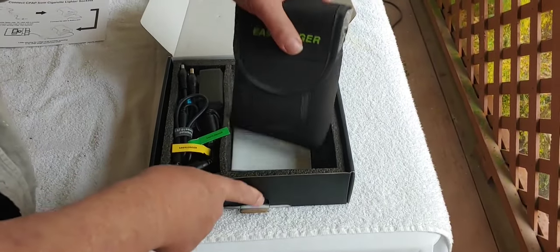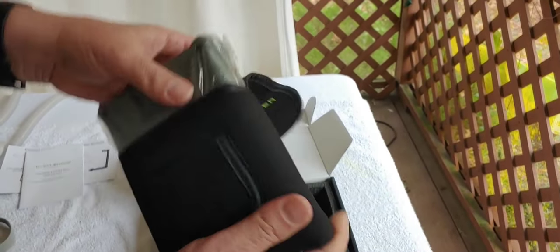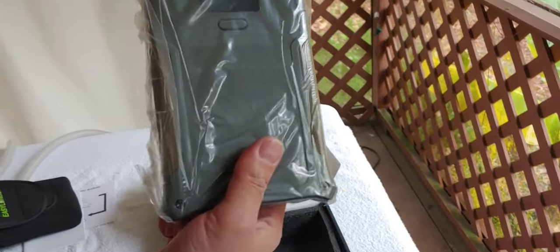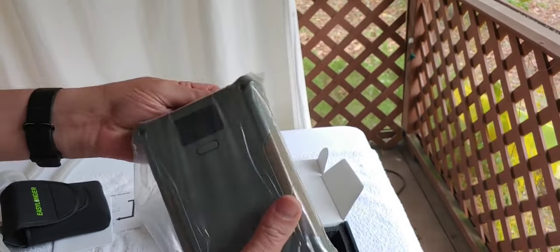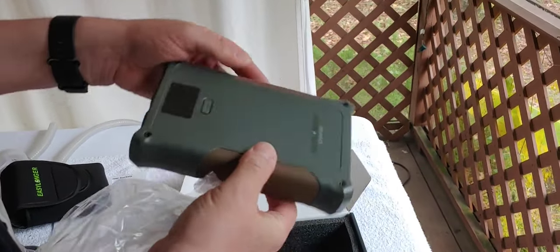So we have a manual. Here's the EasyLonger — it's in a nice little case, much smaller. I'll put a link down to the video I just did recently on the ES960, which is much larger than this. This one is smaller but basically the same configuration, except it doesn't have a handle.